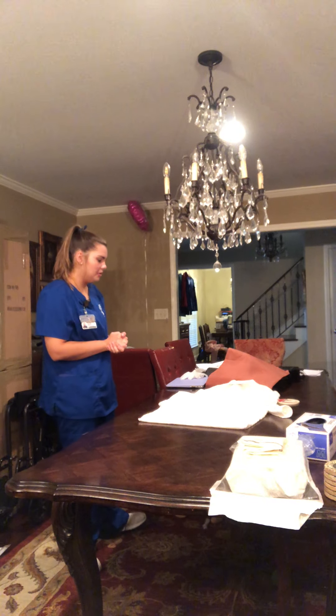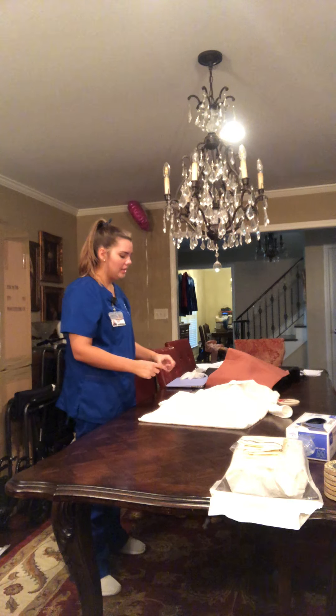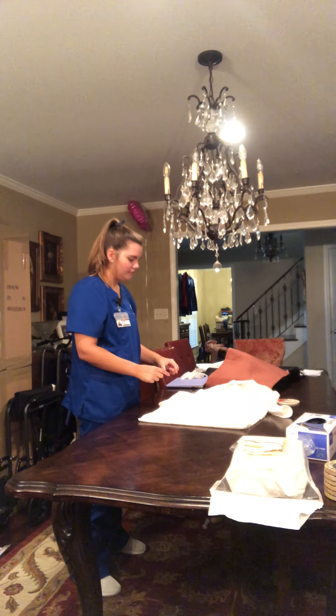Hello, Ms. LMA. My name is Hope Gribble, and I'm going to be your student nurse today. Hand hygiene. If you don't mind stating your name and date of birth. Okay, thank you.